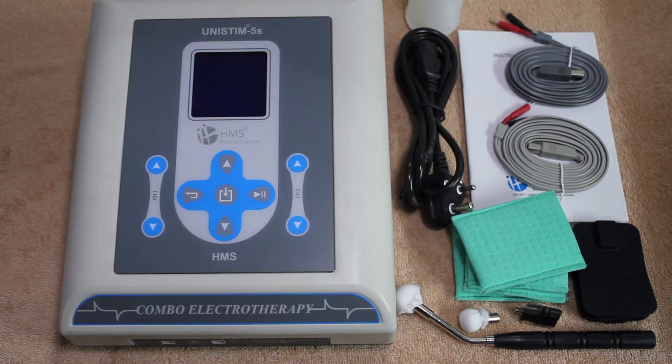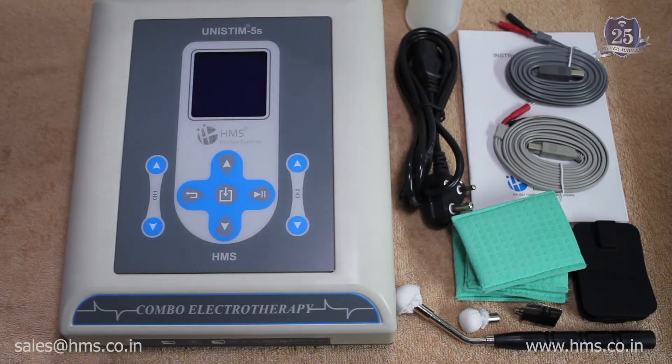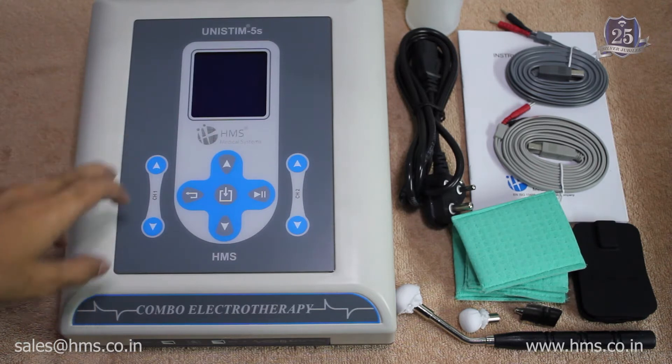This is the HMS Medical Systems Unistim 5S. This is actually a combination therapy machine with six different modalities, except ultrasound therapy.